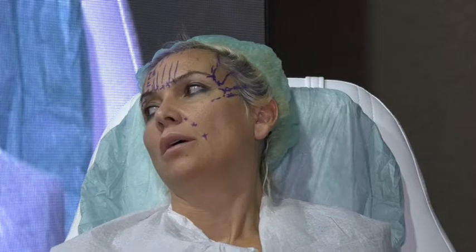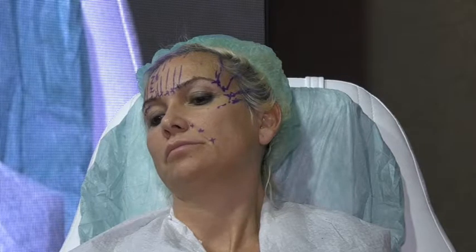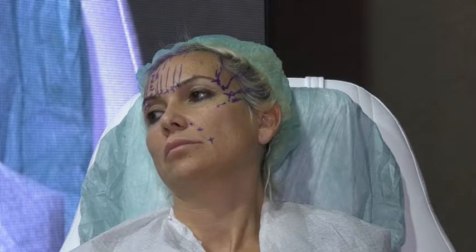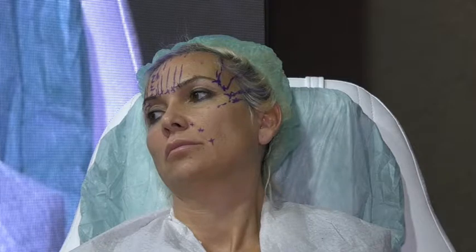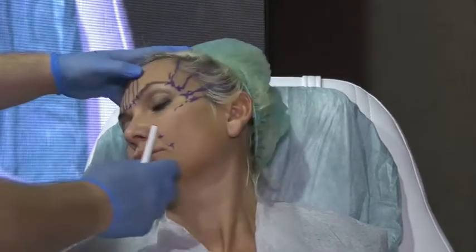Anyway, even if you are confused, you can do even the 3 to 1 point as we did before. So now we will design where we end. This is the temporal zone. Where is the temporal zone? This is the temporal zone. Madam, this is the temporal zone.